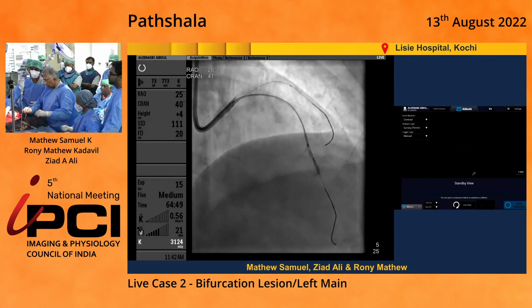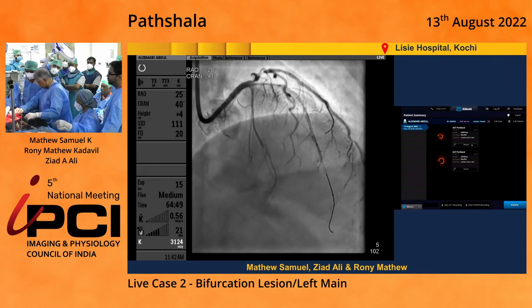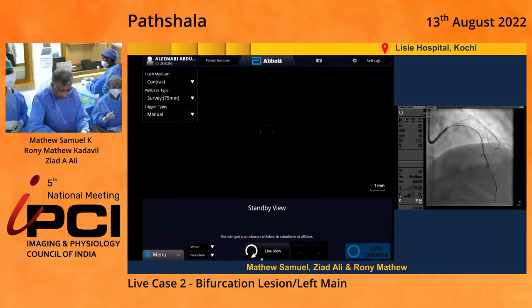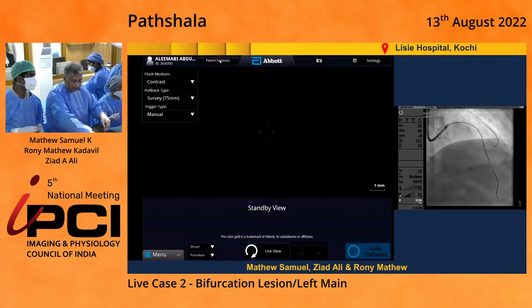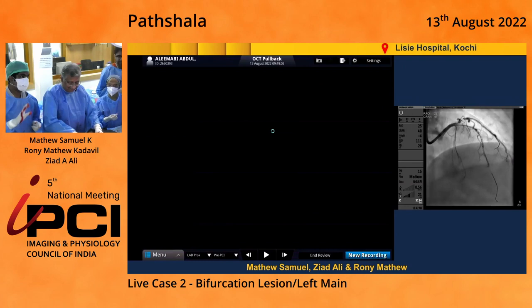Can you guys switch to the OCT for us? What we're doing is we're injecting through the 3cc catheter. And then once the distal vessel fills, we inject antegrade through the main vessel. That's one of the tricks we saw you do on Twitter. I tried to do it myself - it never worked, but today it worked.